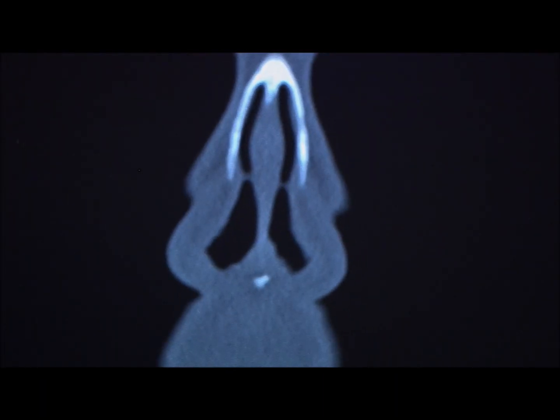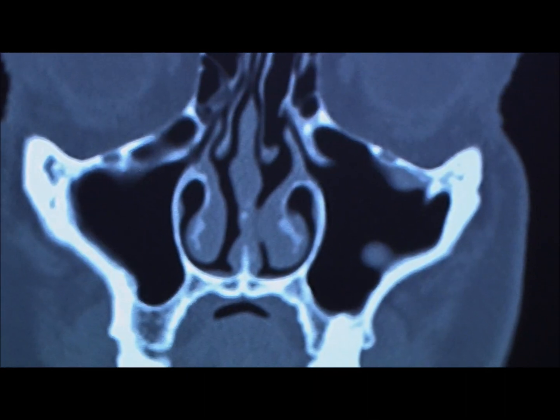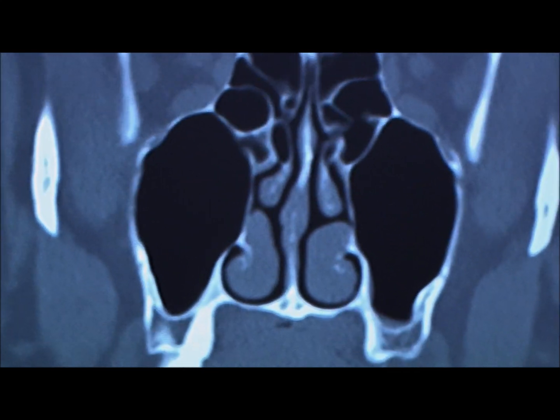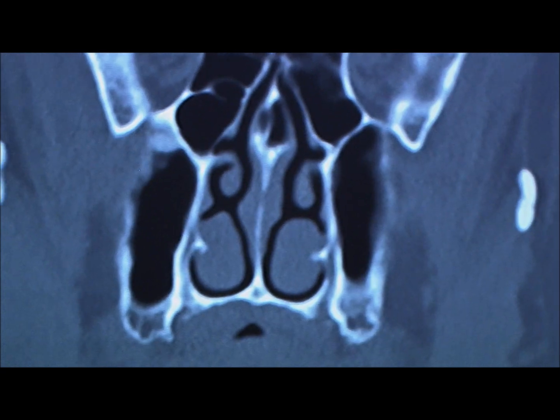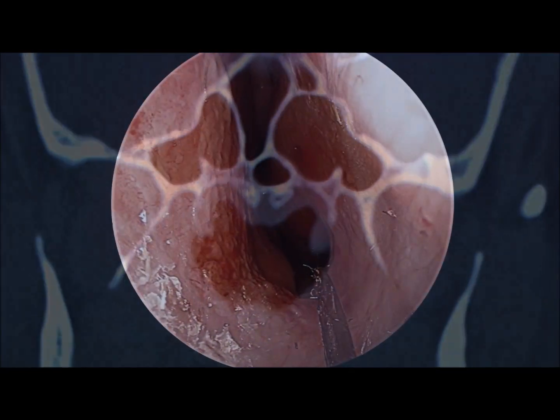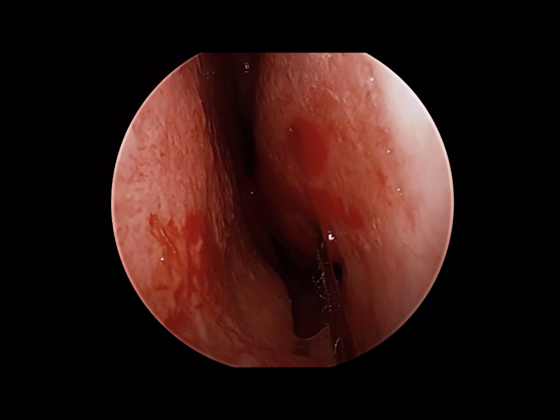This is a different patient. We're looking at a CAT scan slowly rolling through — you can see the patient's septum is okay and their sinuses are really good, but their inferior turbinates were large and obstructing. This patient was utilizing Afrin to a great degree, and therefore their turbinates will be reduced in this case via microdebrider.